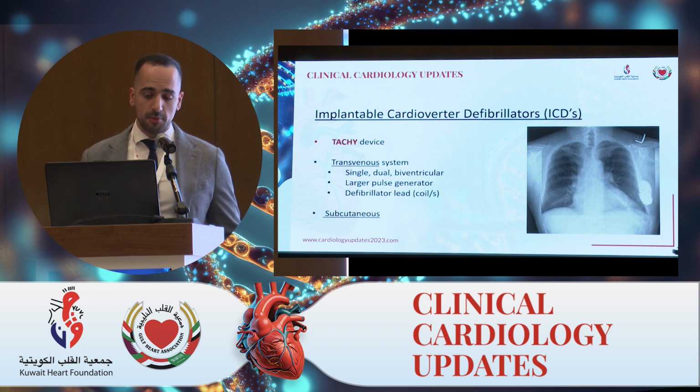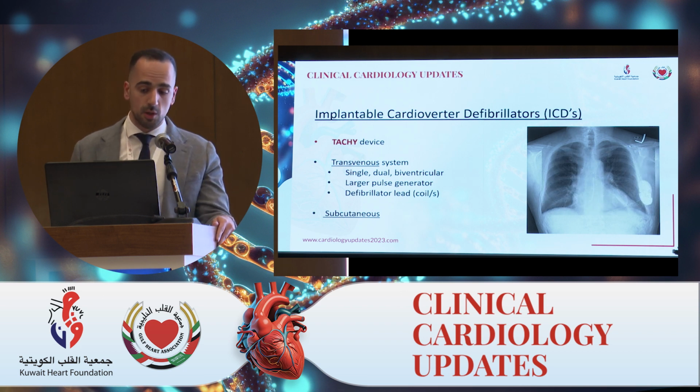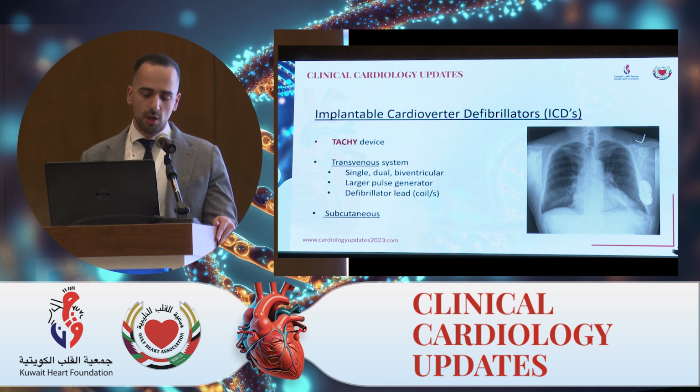And then in comparison, a subcutaneous defibrillator, while also having a lead and a generator, will have a very different appearance, likely in a different location. The generator is more lateral and outside the thoracic shadow, and the lead will traverse over the sternum.